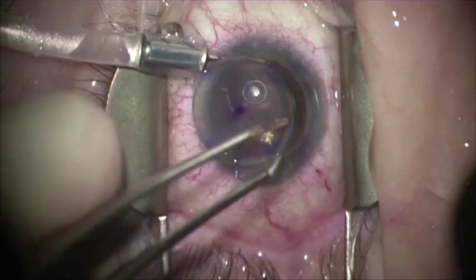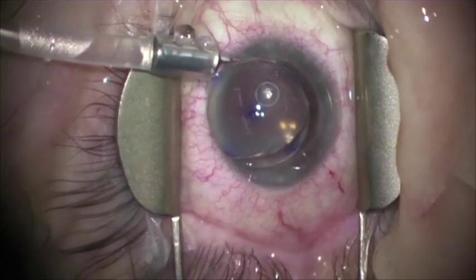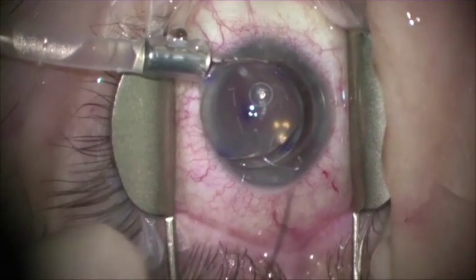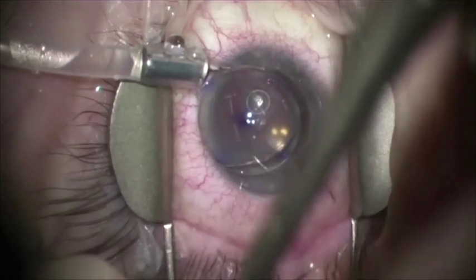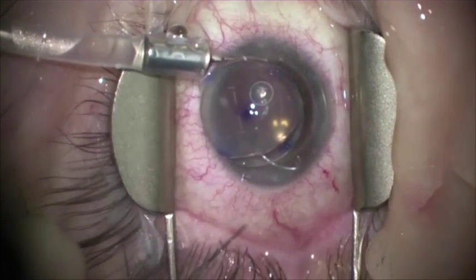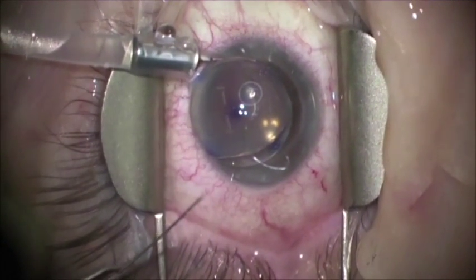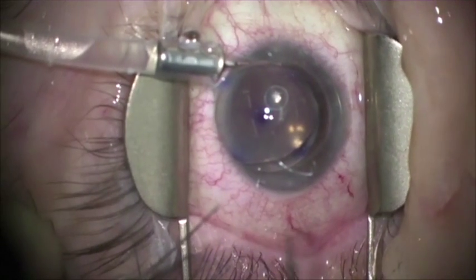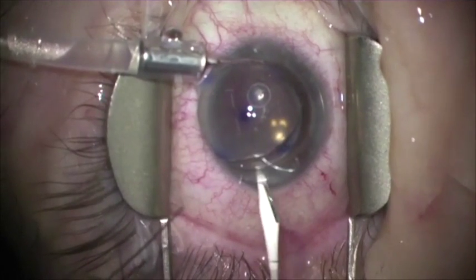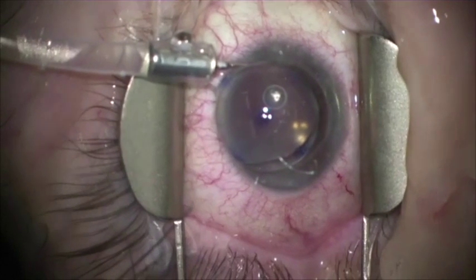Donor graft is transferred into place in these eyes where I've disrupted the epithelium. I like to leave the donor lenticule on the stromal base to protect it from loose epithelium. I use a pull-through technique in cases like this to help ensure correct positioning because the view-in is somewhat inadequate. Proline is placed in a double-arm fashion in the edge of the donor graft. The incision's open to 4.5 millimeters.